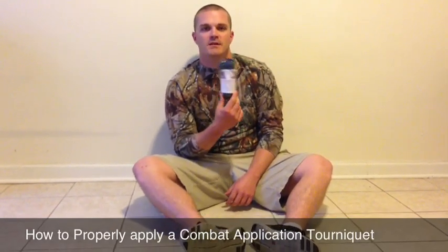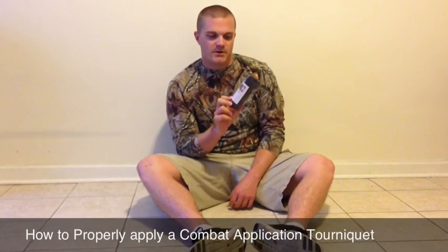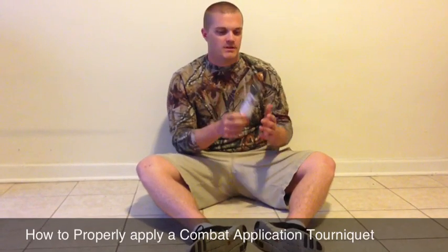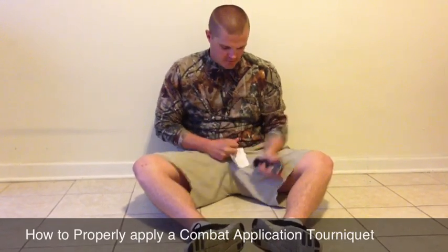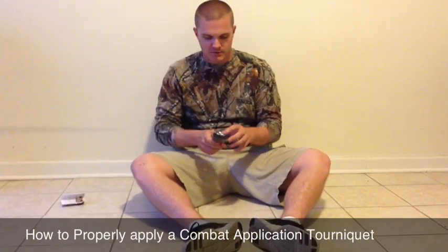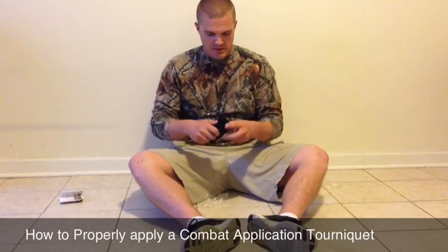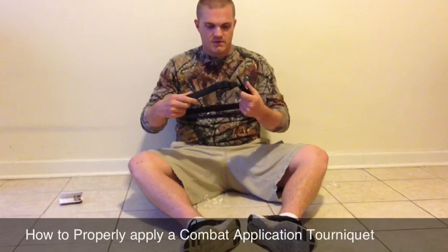Today I'm going to show you how to properly set up and apply the Combat Application Tourniquet by North American Rescue Products, also known as the CAT. This is exactly how it's going to show up if you order one. It does come with instructions if you forget this instructional video. And this is what it looks like out of the package.